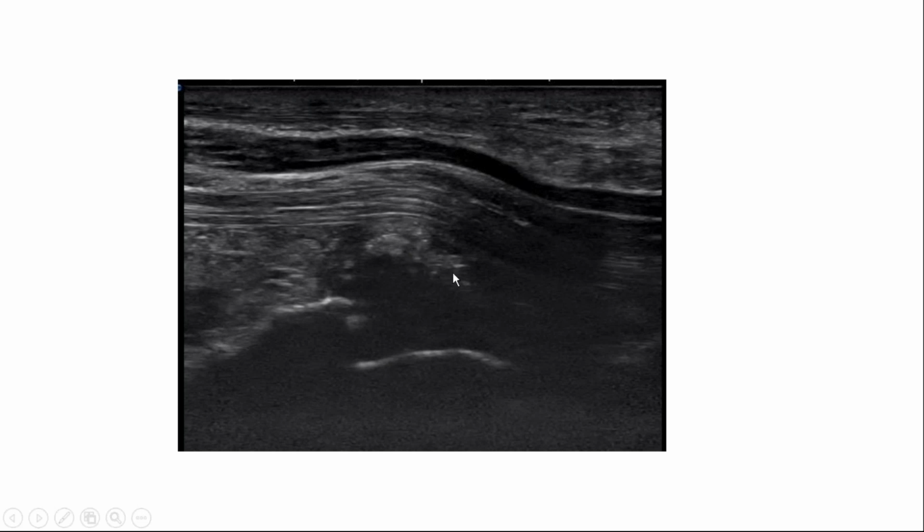So there's some deposit here. Now this patient, I don't know if they have it because the patient didn't know. It could be some type of deposit like gouty deposit or calcific deposit, but definitely a big synovial hypertrophy. So there's a mass which is most likely just a synovial hypertrophy with some type of deposit sitting here, and it's distorting the tendons and the contents of the carpal tunnel basically.